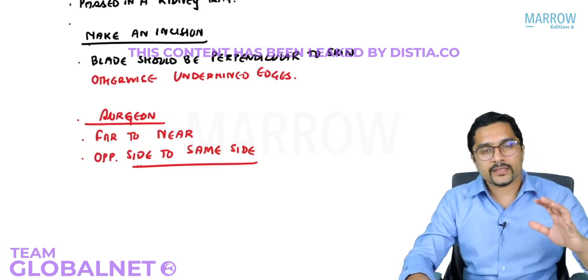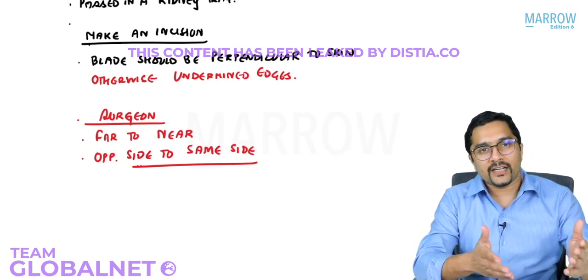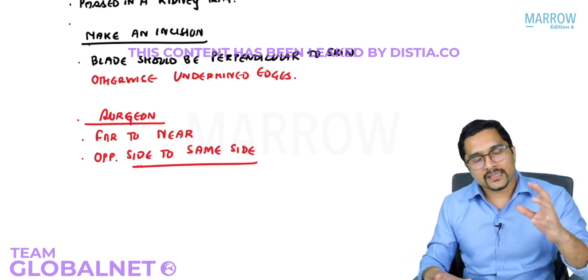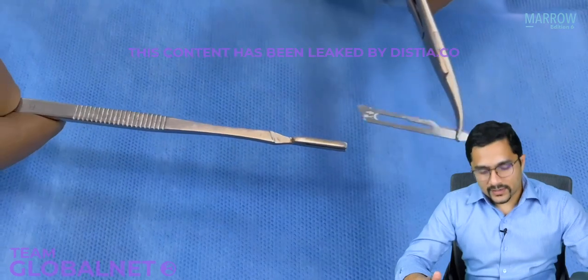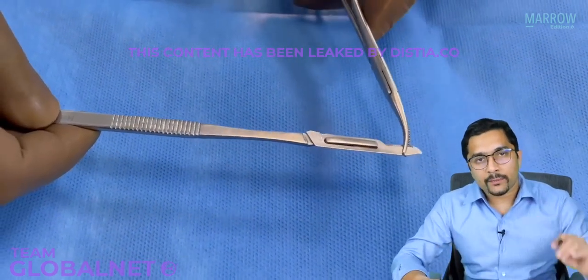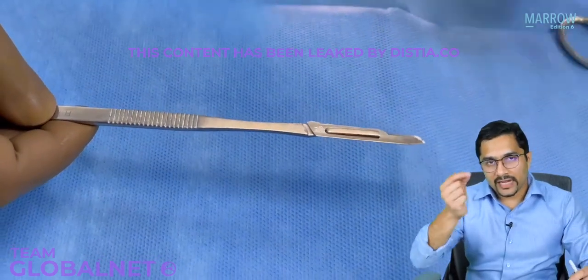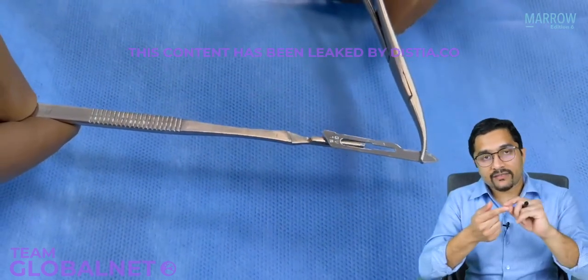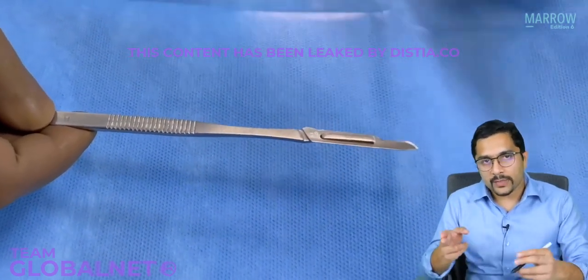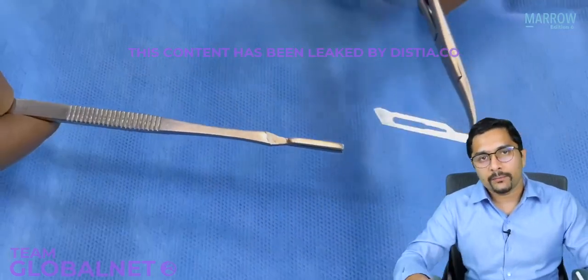These are basic points when you are handed a blade and when you make an incision. Now, to reinforce these facts, let me show you some videos. In this video, you can see that the nurse is mounting the blade on the BP handle. We never handle it with our hands because we can get a cut. So you always use a mosquito to hold the blade and mount it on the BP handle.